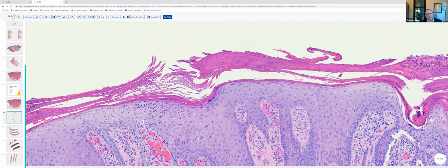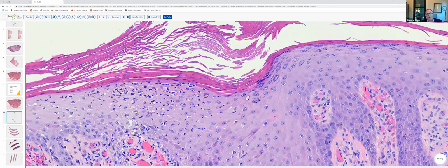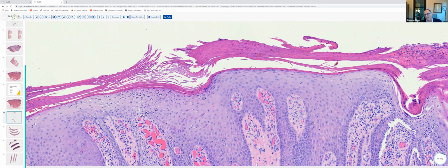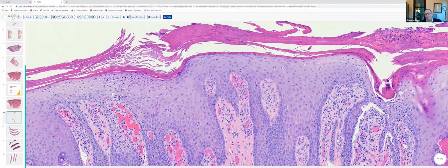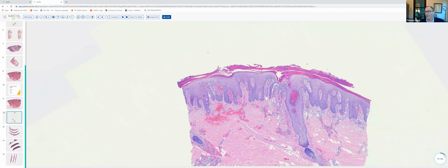There are collections of neutrophils within the epidermis, some forming small spongiform pustules. The papillary dermis contains dilated and tortuous vessels, and these closely approximate the undersurface of suprapapillary plates that are quite thin. There were a few suprabasal mitotic figures within the epidermis, and there's a sparse superficial perivascular infiltrate of lymphocytes centered around vessels of the superficial vascular plexus. So really, we have everything here that one would want to see in a lesion of plaque-like psoriasis.